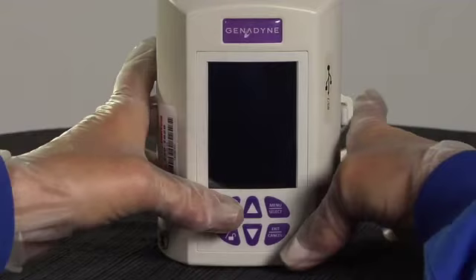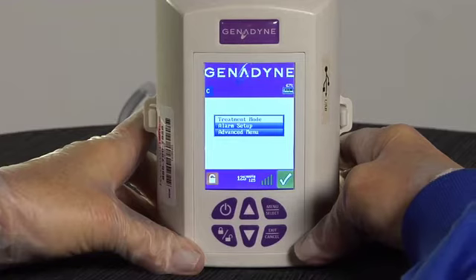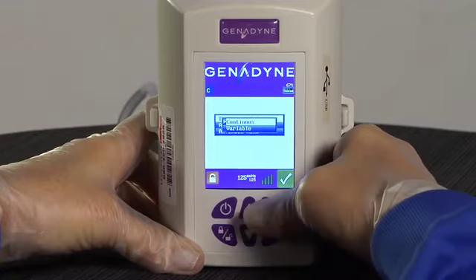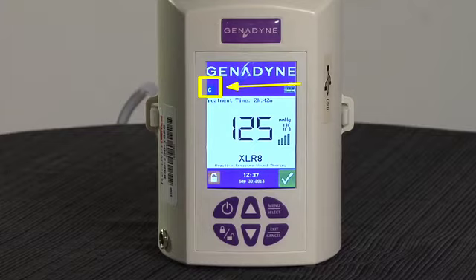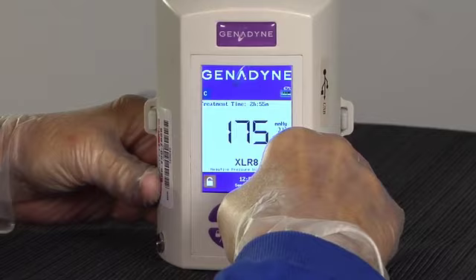To program Continuous Therapy, first turn the pump on by pushing and releasing the on-off button. Press the Menu Select button and the menu will appear. Use the Up or Down button and choose the Therapy Mode function by pressing the Menu Select button. Select Continuous and press the Menu Select button. Press the Exit Cancel button twice to return to the home screen. The C symbol will be displayed to indicate Continuous Negative Pressure Therapy. To quickly ramp up or down, hold the Up or Down arrow key and the pressure setting can be changed in increments of 10 millimeters of mercury.